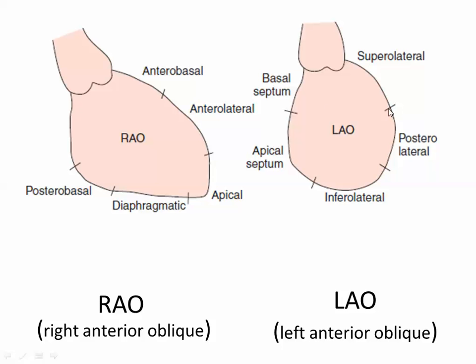So what are the walls? Septum, anterior, lateral, inferior. Okay? So what's the vessel going to the septum? The LAD. What's going to the lateral? LCX. If the circumflex is dominant, it will give the PDA to what? Inferior. Okay. Where do you expect the RV?